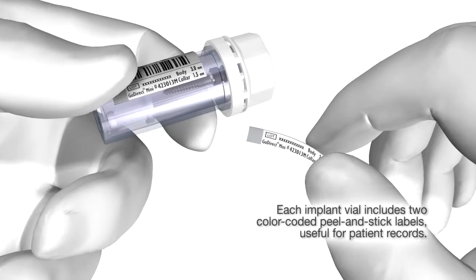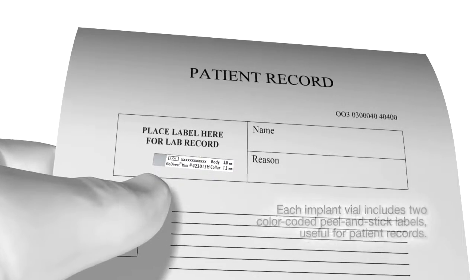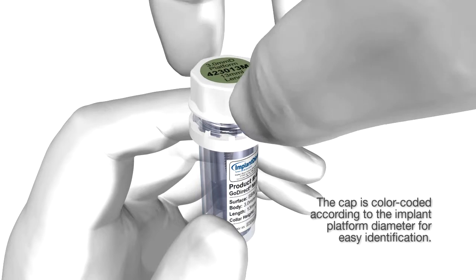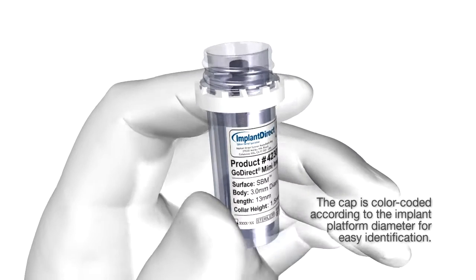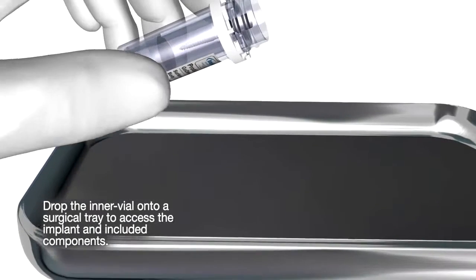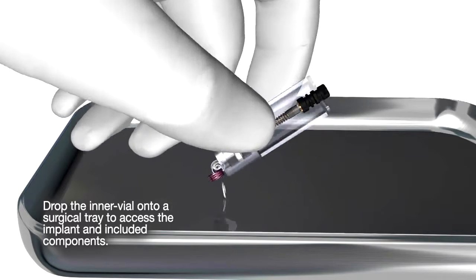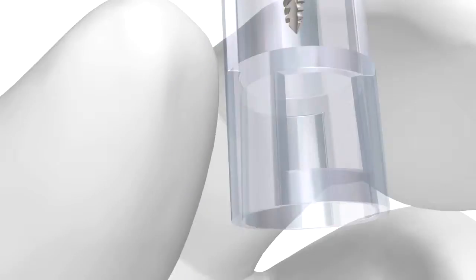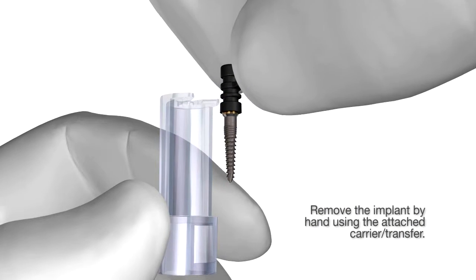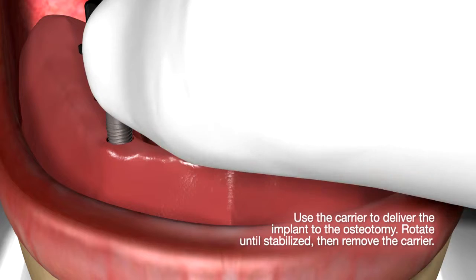Take the tag off of the implant, put it onto your patient record. This is a 3.0 millimeter mini implant, mini GoDirect implant. There's a snap comfort cap also packaged with that. Just turn it with finger pressure and then ratchet it to place.